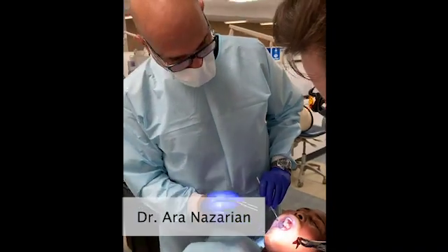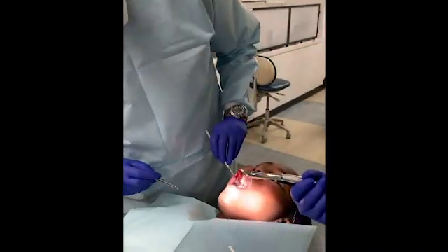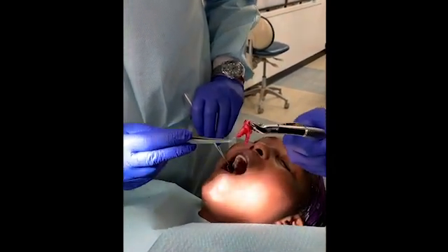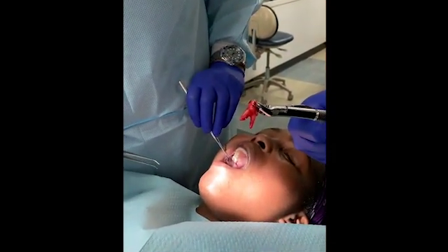Dr. Sawyer went ahead and took tooth number two out. You can see the roots that are involved there, and he got it all in one piece.